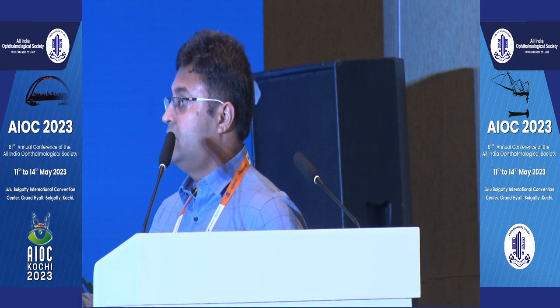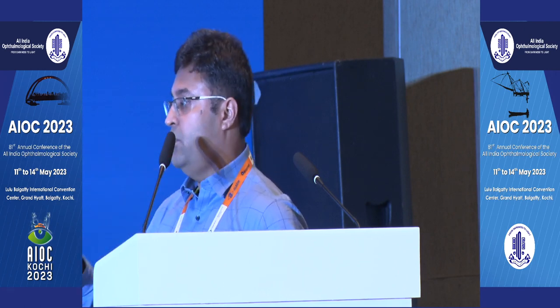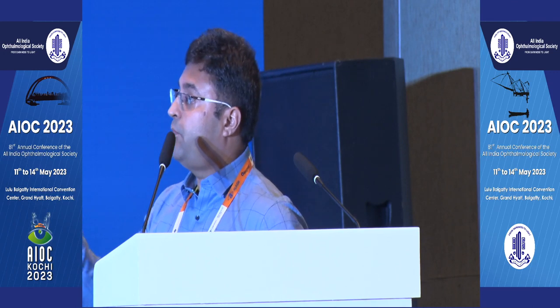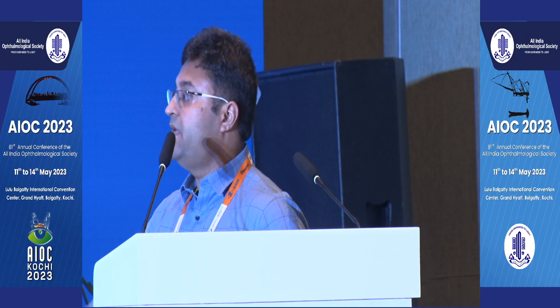But there is no exact way, because all the time you are doing the vitrectomy, the infusion pressure, the bottle height, is really low. You cannot really gauge it unless you have a positive pressure system wherein you can measure pressure. But the bottle height would be at the lowest.